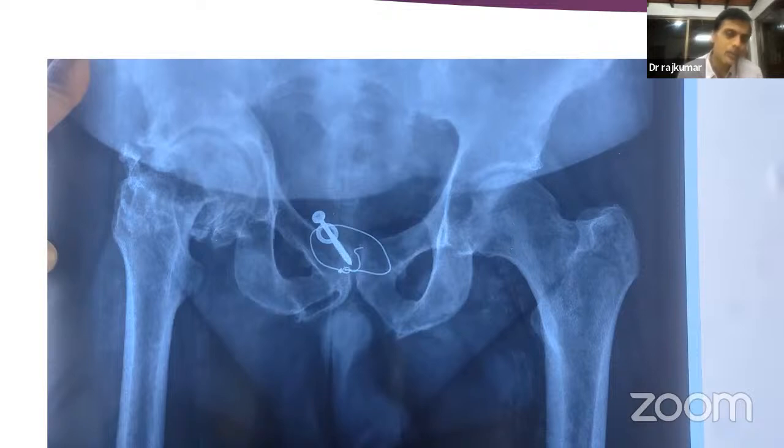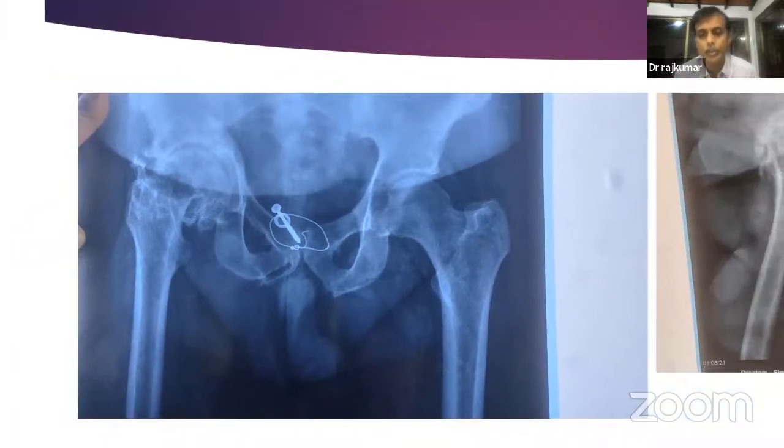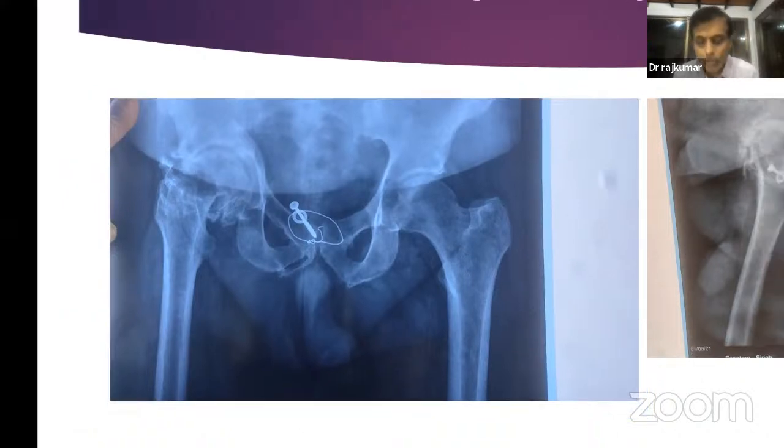So yes, in this situation, even though you can do a lot of CTs and everything, two important points. One is, you need to see perioperatively how much of anterior and posterior walls are there. That is where you are going to get your good fixation. So based on the walls, if you are able to manage with the jumbo cup, you don't need an augment. If your wall is not good, you cannot put a jumbo cup, then you need to put a smaller cup and then use an augment. Otherwise, if you are able to get in a jumbo cup, then no need of an augment. So it all depends how we are going to ream, how we are going to place your cup.